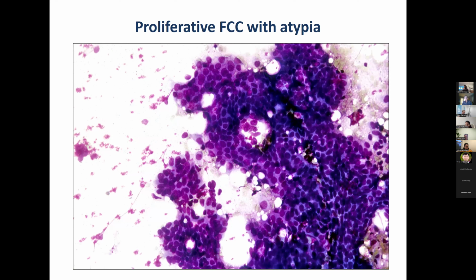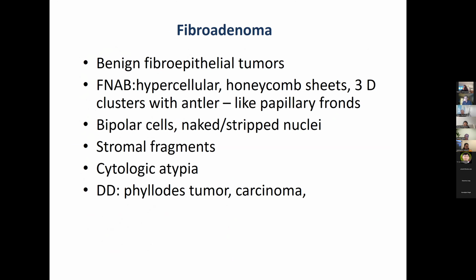There's a lot of overlap between fibrocystic changes, papillomas, fibroadenomas even, because when I describe the fibroadenomas, you will see the antler-like configuration, which you can also see in fibrocystic changes. So a lot of things have to be put in context. So let's go to a more benign entity like a fibroadenoma.